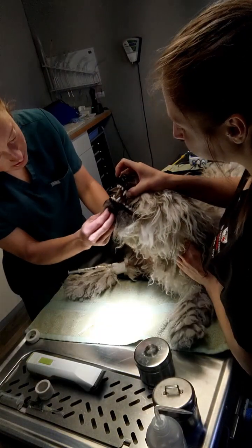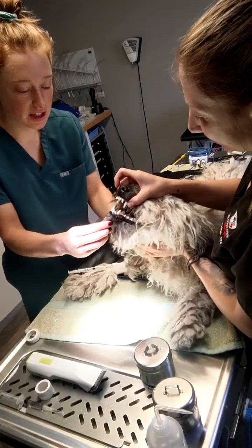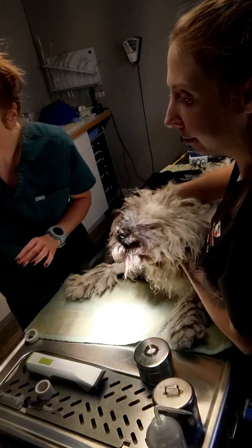I'd say that's better. So she doesn't have much jaw tone. She's not fighting back much to open her jaw. So that is the sign that we want to look for. So we're going to proceed with intubating.